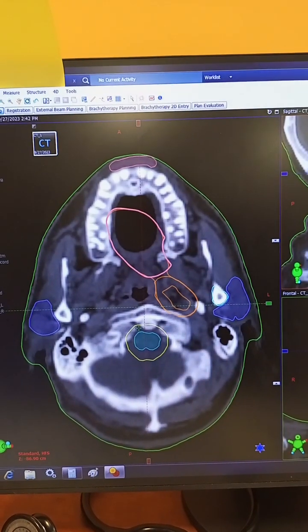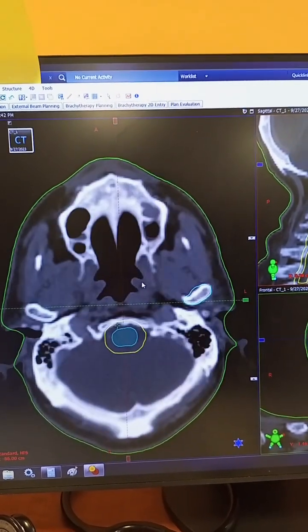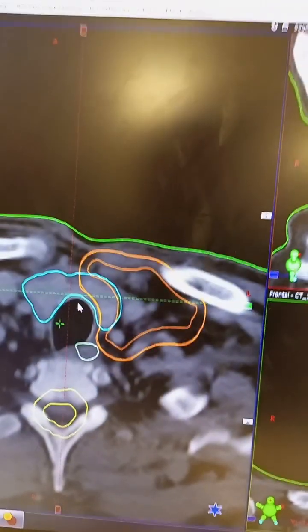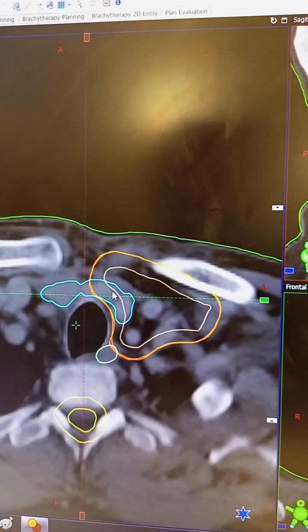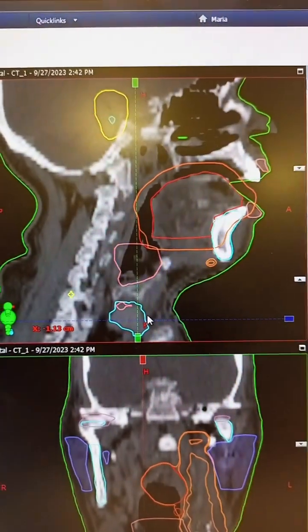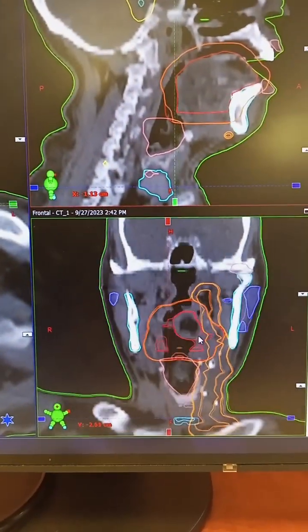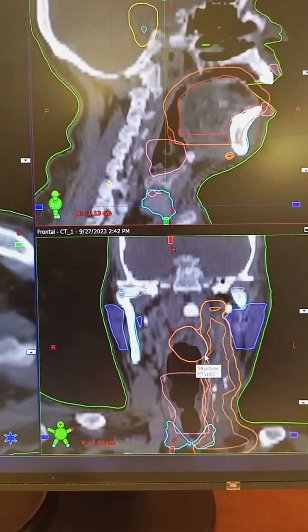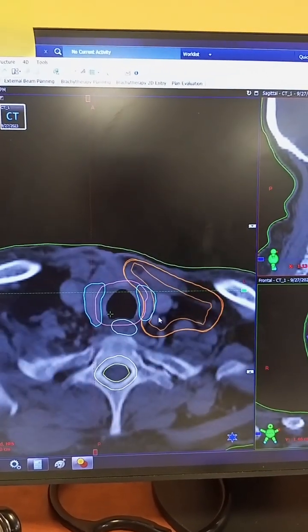The thyroid is also a very important endocrine organ at risk. It is located just anterior to the trachea and thyroid cartilage. We have drawn the left lobe, right lobe, and isthmus of the thyroid. You can trace this bilobar structure in front of the trachea. We have also drawn the TMJ joints — both left and right. There is a fine differentiation between the mandibular part and the temporal part of the temporomandibular joint.